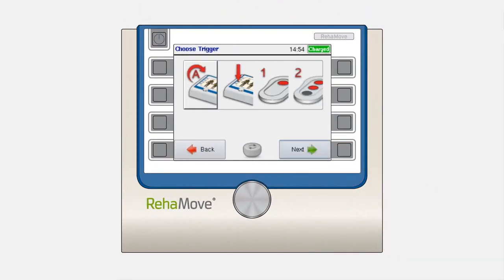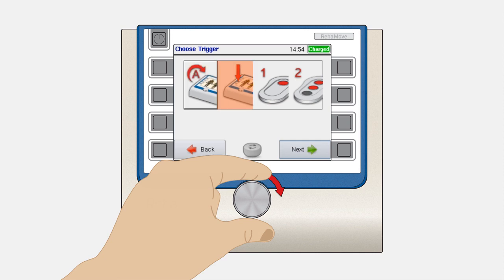By pressing the next button, you will be automatically forwarded to the trigger selection. Using the knob, you can select the trigger.